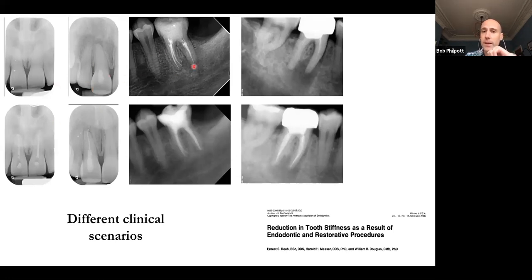And then sometimes we get these retreatment cases where we've got a lot of tooth colored material right down onto the pulp chamber floor, a little bit of gouging of the pulp chamber floor from a previous treatment, or maybe from our own previous attempt to locate canals in a primary case. And that makes it complex to get back in there and find, I suppose, what we're looking for, because sometimes that initial map may be damaged or slightly affected by what we have done ourselves.